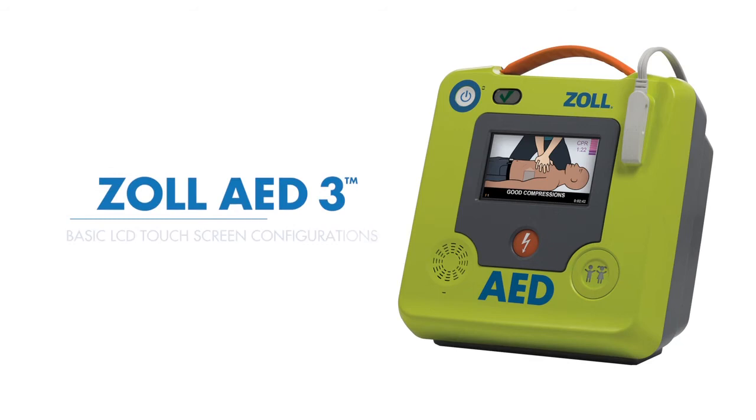The Zoll AED3 has two layers of access within the LCD touchscreen. The first layer includes basic configuration capabilities and provides access to general device information. This layer is not password protected. The second layer has more advanced configuration options, which is password protected. In this module, we will discuss the first layer, or basic configuration options.